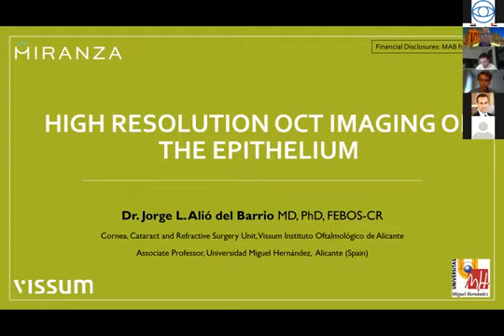So in this talk, probably I will repeat some points that have already been pointed out, and likely Mazen in the next talk will also repeat some of the main concepts, but I think it's very important. And probably one of the main advances of the MS39 and modern anterior segment OCT technology is that it is able to provide the epithelial imaging and the epithelial thickness maps.